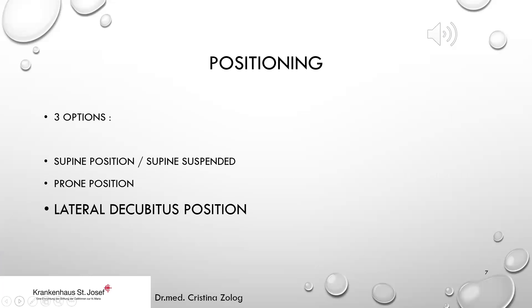There are three options for positioning the patient for elbow arthroscopy: the supine position or supine suspended, and the prone position. In our clinic we recommend and perform elbow arthroscopy in the lateral decubitus position, and I will demonstrate the basic setup and portal placement in this positioning.